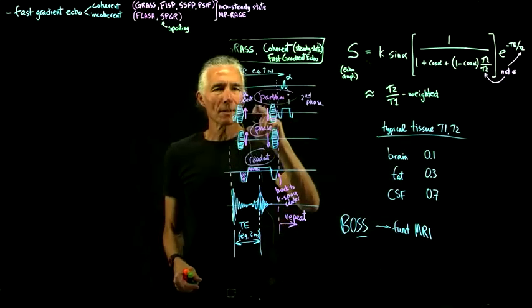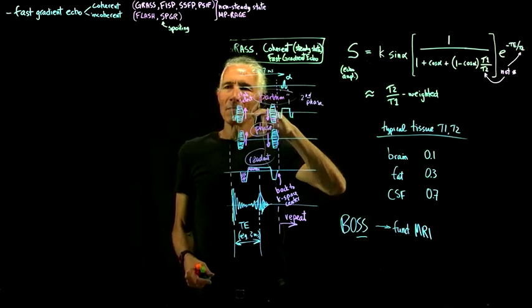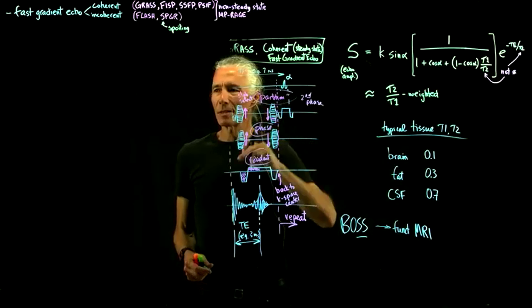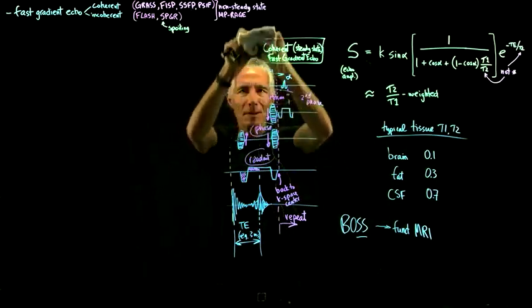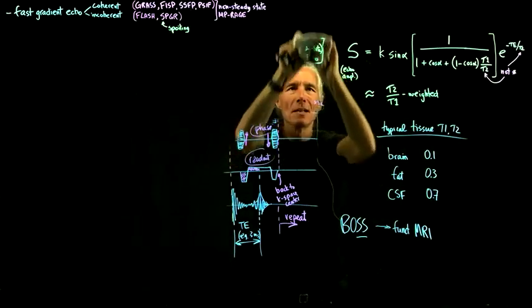Here you can afford to go up to a higher flip angle, because you're patching up the magnetization, you're not just trying to throw it out. But yes, often you're doing so many RF pulses, you might not want to have it be a full 90.